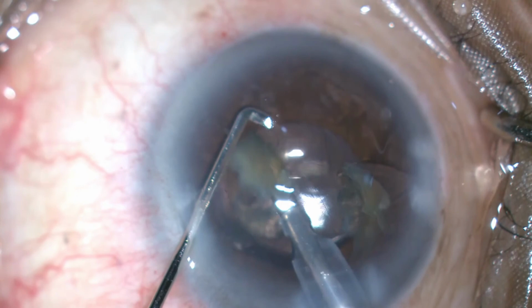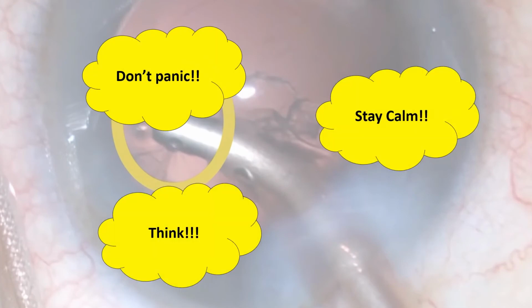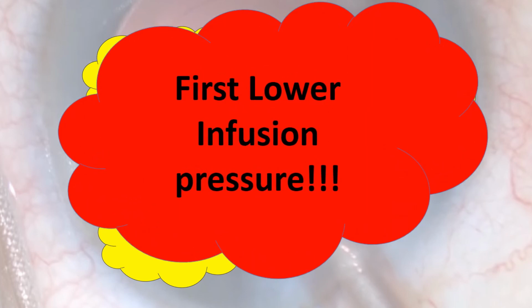So, the moral of the story is, you hear everyone say when a PCR happens, don't panic, stay calm, think everything over. I say, first lower your infusion pressure and then do all those things, because most certainly it will make your life much easier. Truly said, a stitch in time saves 9.